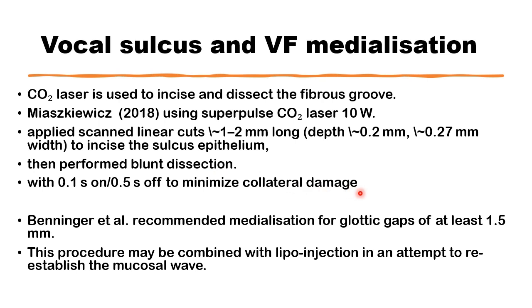At the end of the operation, the vocal fold bowing should be corrected by a medialization process, particularly if the glottic gap is about 1.5 millimeter or so. The procedure can be carried out by lipo-injection or a type 1 thyroplasty operation.